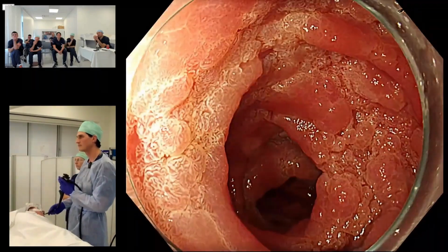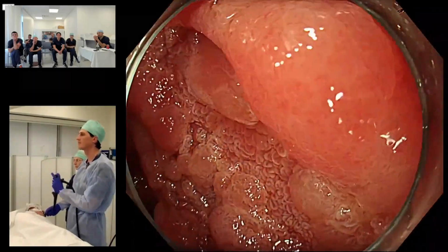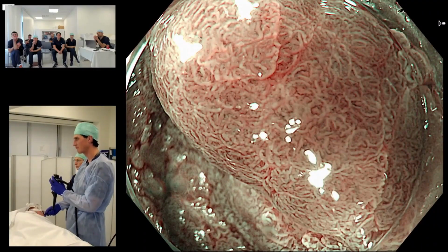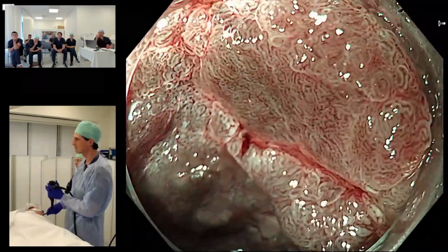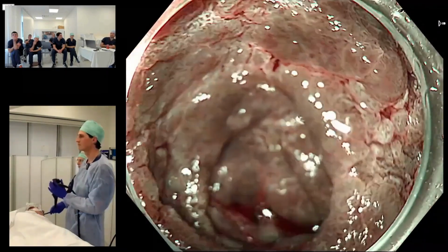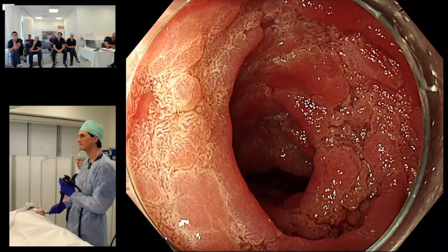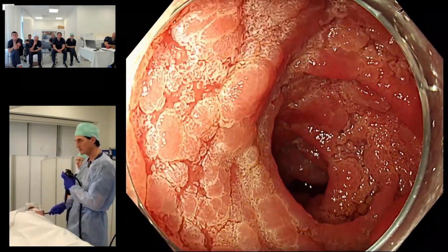If you just go up to one of those red areas and put on NBI, you'll see that it does have a vascular pattern that is regular. It's just a little bit more colon polyp like the other one that we saw. So I think the first thing that concerns people is that it means there's cancer in it, and I'm pretty certain that's not the case. It's just different morphologies within one lesion. And what do we think about the most important feature of this? Yes, I will come back onto it.